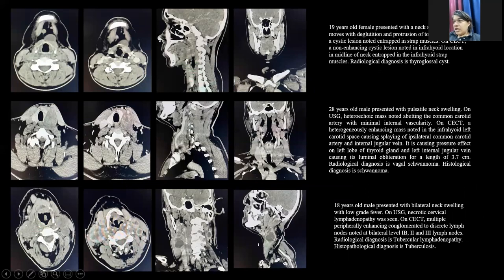A 19-year-old female presented with a neck mass that moves with deglutition and protrusion of the tongue. A cystic lesion was noted trapped in the strap muscle which was non-enhancing. The diagnosis of thyroglossal cyst was made.